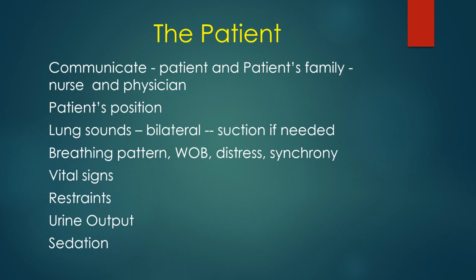So you hear rhonchi, bubbling, gurgling over the large airways. You suction him if he needs to be suctioned. And you want to listen for crackles in the bases or wheezes and all the kind of stuff that you would listen to in anybody's lung sounds. Every time you go check your vent, you should always be listening to the patient's lungs.